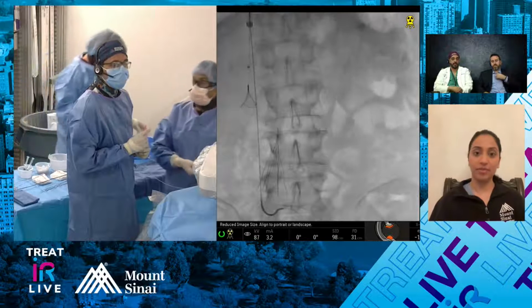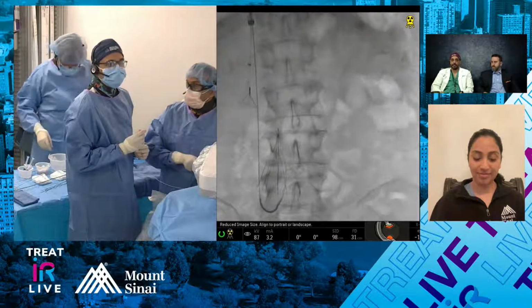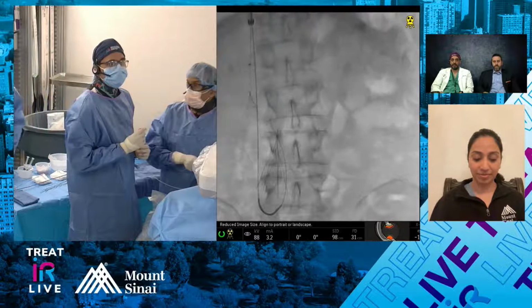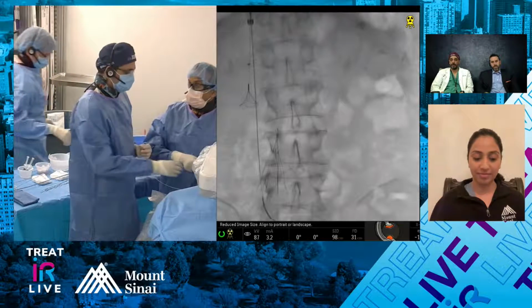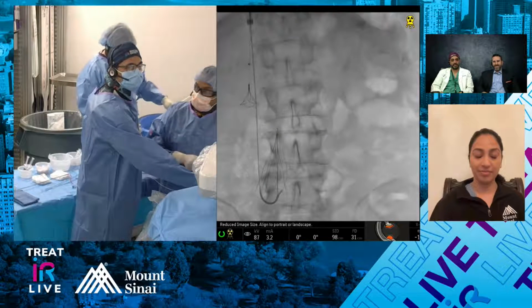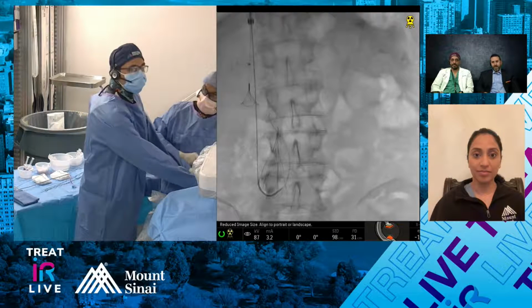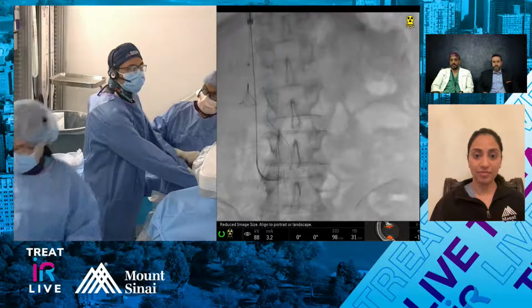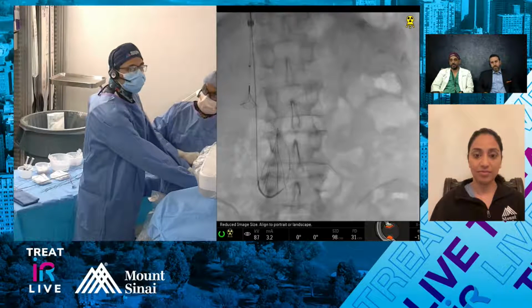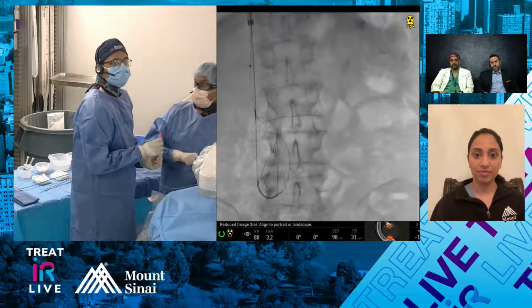It depends on how much clot there is. If it's just a little bit of clot hanging off the top, if they're not on anticoagulation, I'll put them back on for a short period of time and then rescan. Although I find invariably the clot's still there. It seems like it doesn't really get rid of it, but that's sort of what the textbook answer is, to try the anticoagulation. If it's a lot of clot or the filter's obviously occluded, then I don't think AC is going to work, and then we have to sort of work through a truly occluded filter.